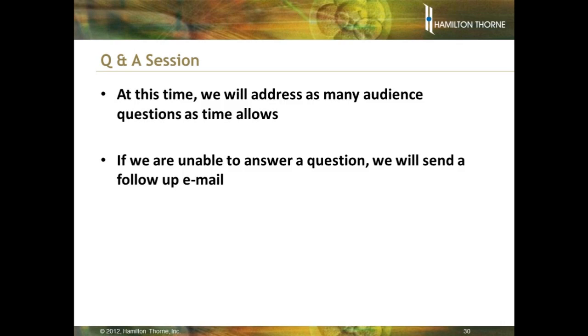And I would recommend one thing there, which is that in making any holes of this sort, use a lot of small pulses rather than one or two really big ones. Because if you make a big pulse, the heat will convey itself into the other blastomeres. If you make a lot of small pulses, it won't get anywhere other than where you're trying to hit.